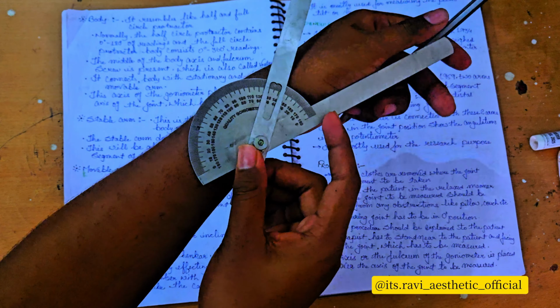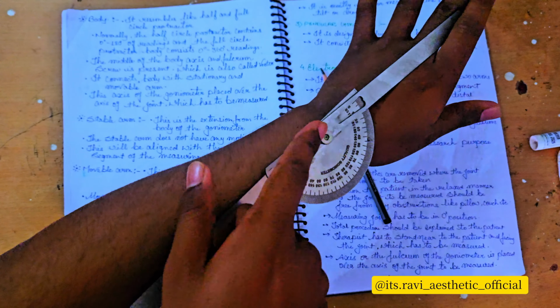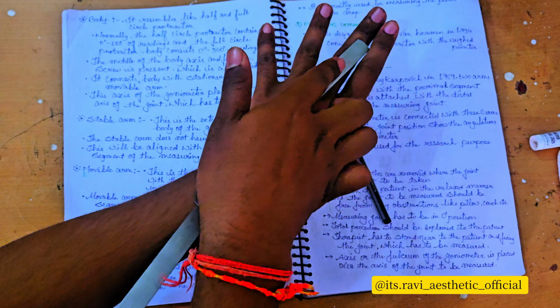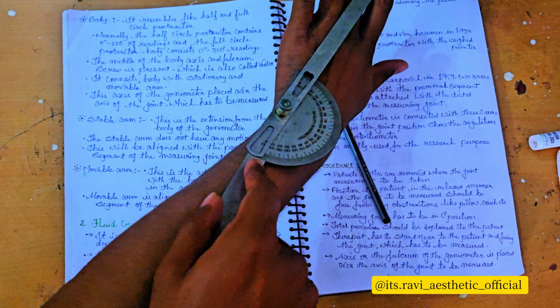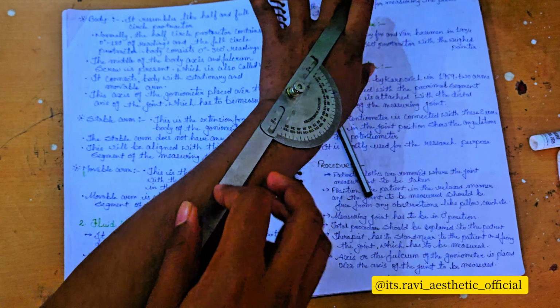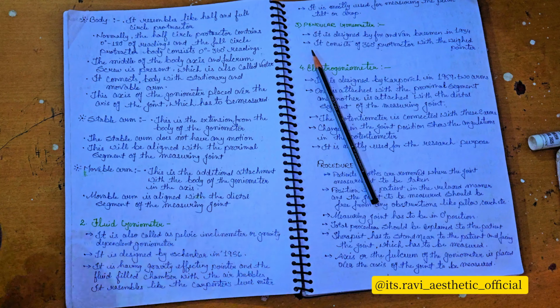So here I can see radial and ulnar deviation. The fulcrum is placed over the wrist joint in between, the movable arm is along the middle phalanx or the middle of the first, second, third metacarpal, and the stationary arm is placed along the interosseous membrane between the ulna and radius. So this is for measuring the ulnar deviation and the radial deviation. That is the axis of the goniometer for measuring any kind of joint movement.